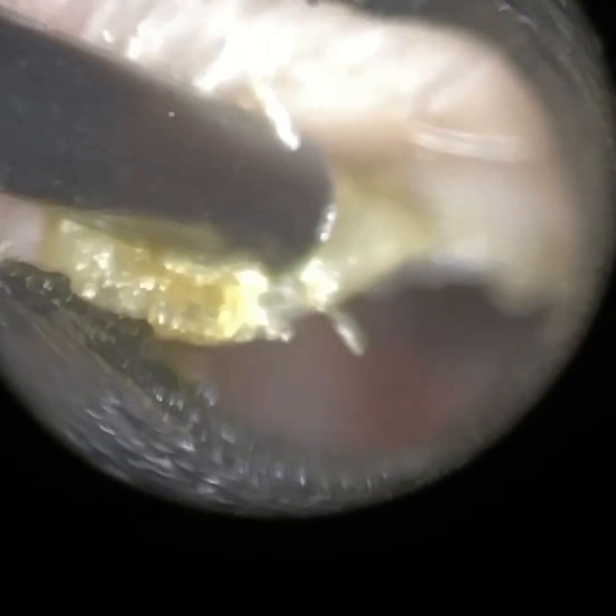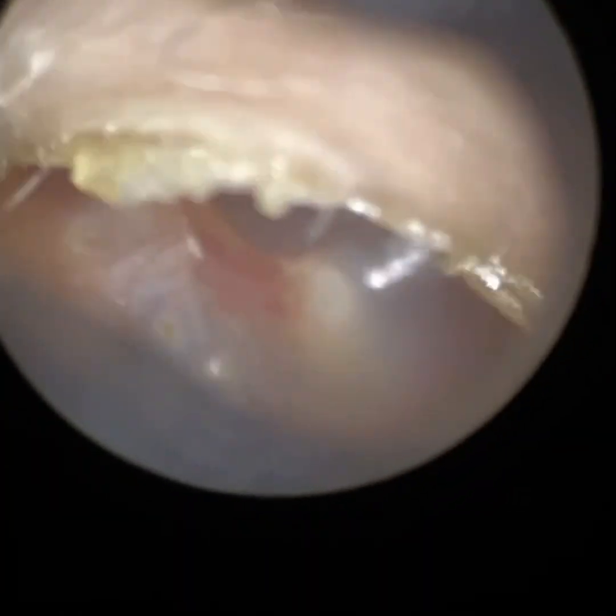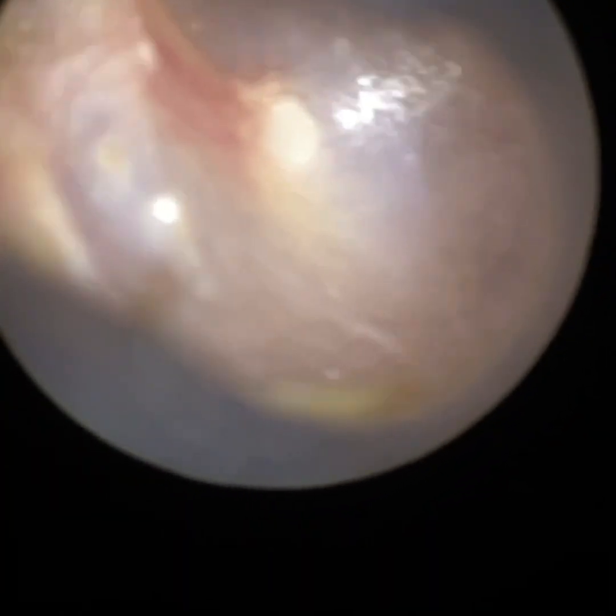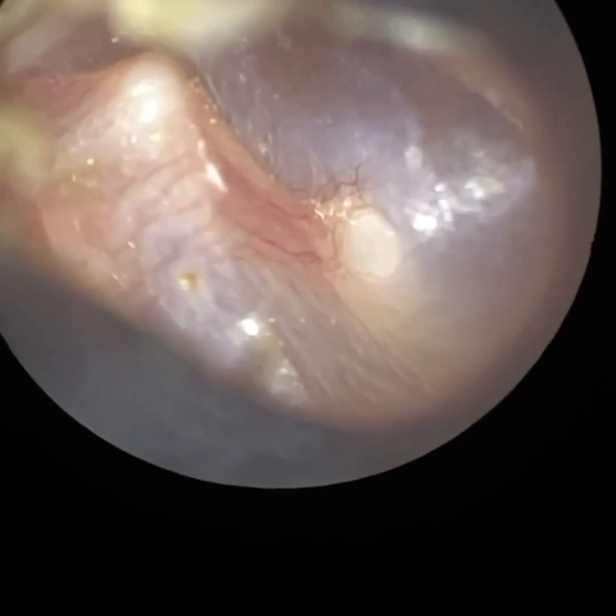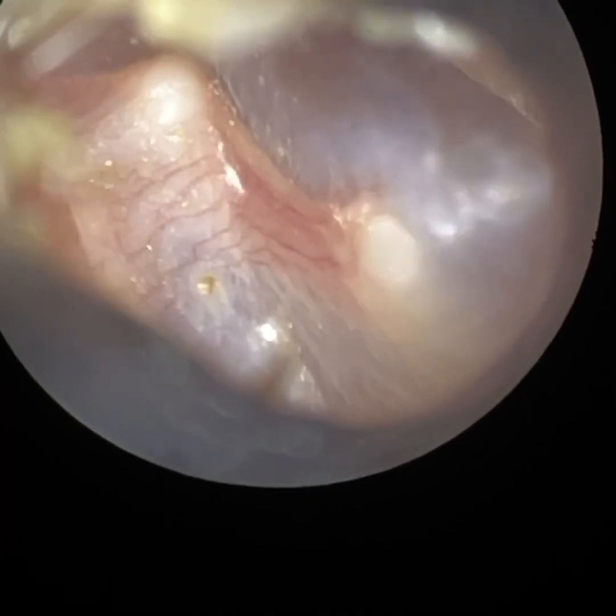We're nearly done — just a bit of keratin at the roof of the ear canal. Getting that in focus, gently peeling away, doing this safely without bumping into the canal wall. We can see the suction probe very clearly. Now I'm just adjusting the focus on the patient's eardrum — you can see we've just adjusted that. Slight retraction there, and you can see all the blood vessels.